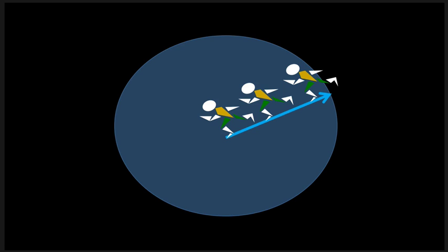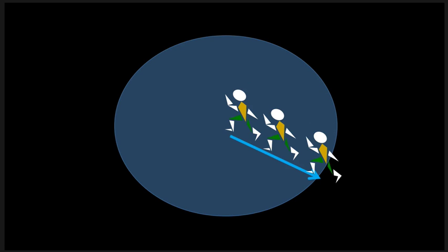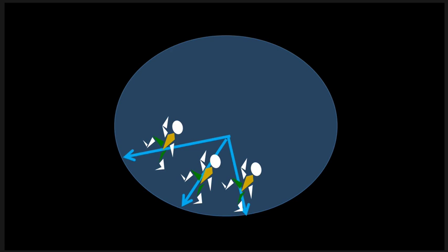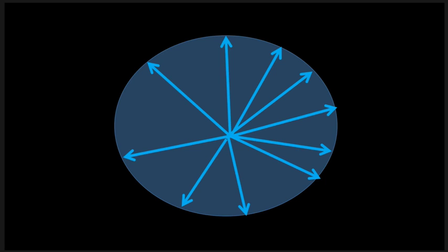These guys are identical. They're gonna be staying right next to each other for a while, and then maybe one of them just happens to train a little harder than the other, and the other guy had Taco Bell for breakfast, and that was just a bad idea, and so he starts to lag behind. The other guy starts to pull ahead, and the other guy's in the middle. And then, even though they're pretty similar, eventually they begin to dephase. But that happens more slowly when things are very homogeneous.